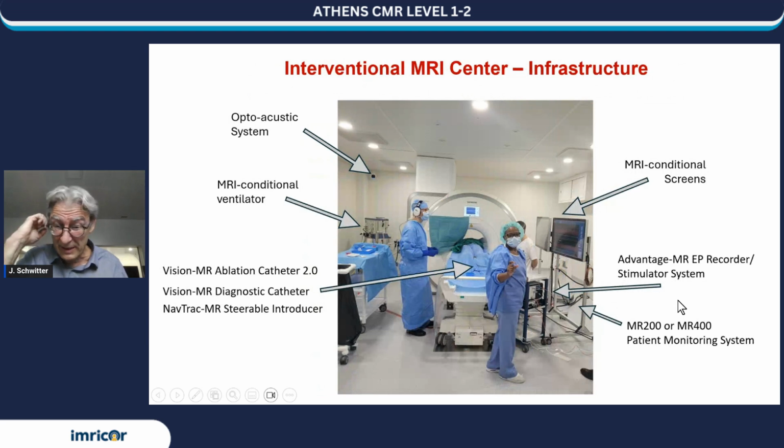And this is what you need. This is, as I said, a new center, so everything was installed from zero, but you can also have a scanner which is used for routine diagnostic procedures in imaging, and you can add a few things that you should have, and then you can convert a conventional diagnostic imaging device into an invasive device, so you don't need to buy a new scanner and construct everything from scratch.